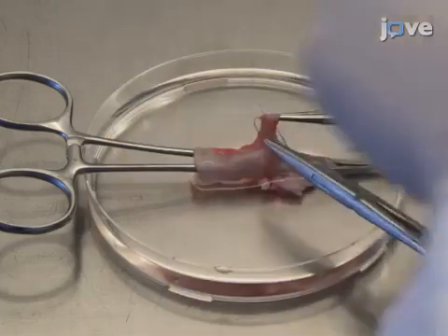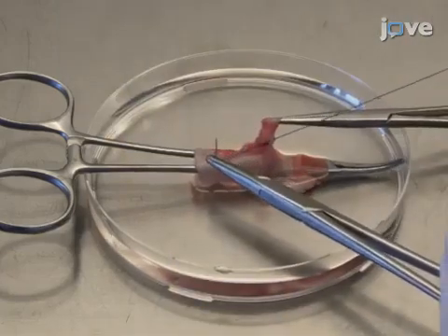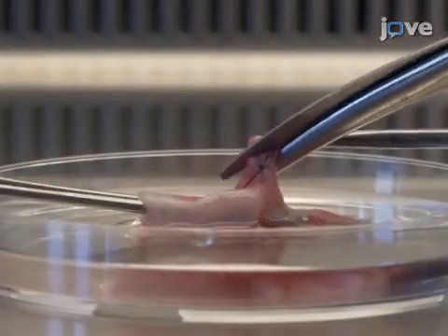Use ligatures to close any branches of the vessel, and then use surgical scissors or a scalpel to remove the branches.